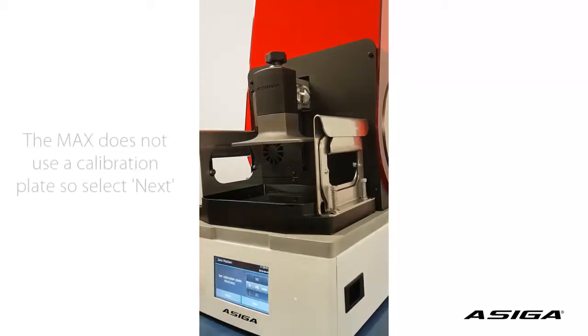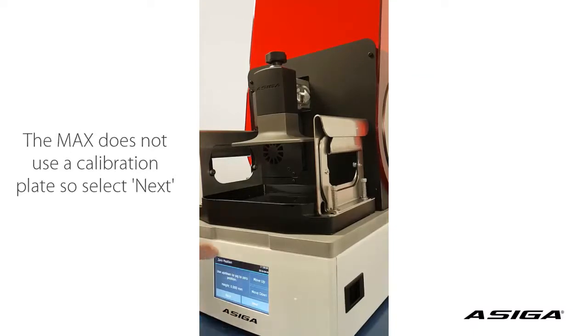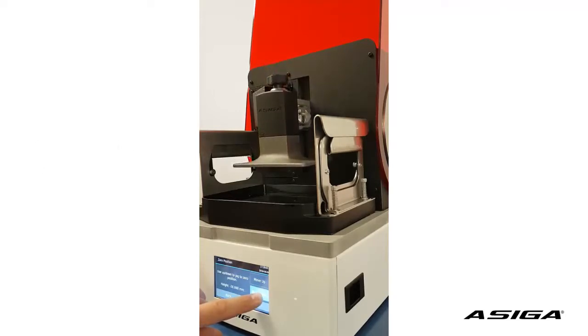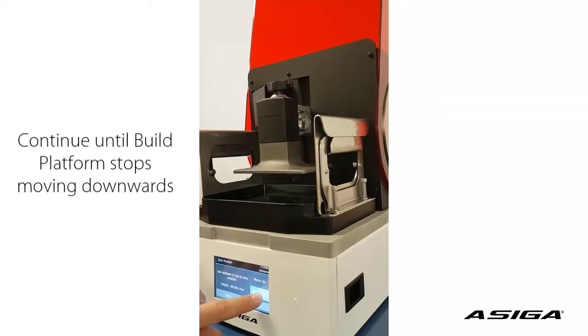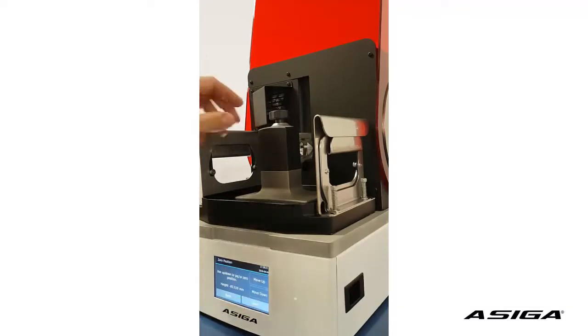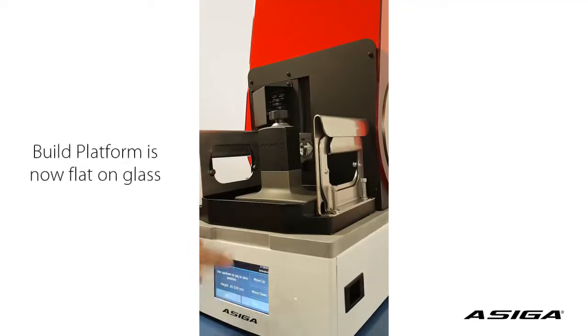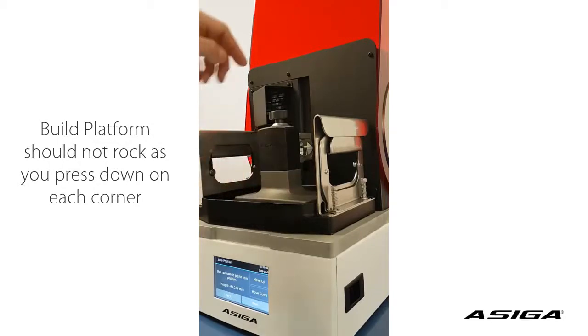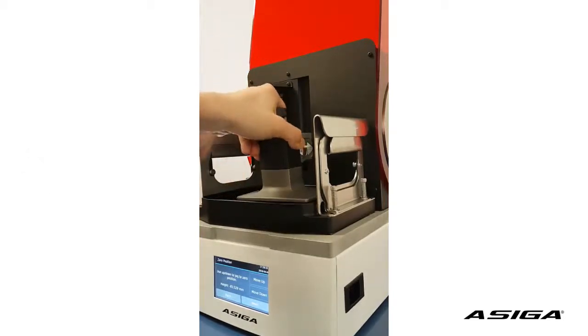Now we click OK. We don't have a calibration plate, so we don't set a calibration plate thickness. And we move down until the axis stops moving. We can't move further down — the platform is lying flat on the glass. This is important so it's not tilting or rocking, and we still have a little bit of play when we lift the platform.